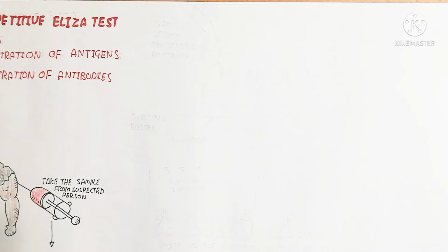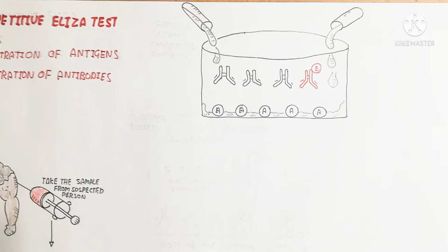Now let's understand the sample serum containing antibody as well as the enzyme linked antibody present in this microtiter well.